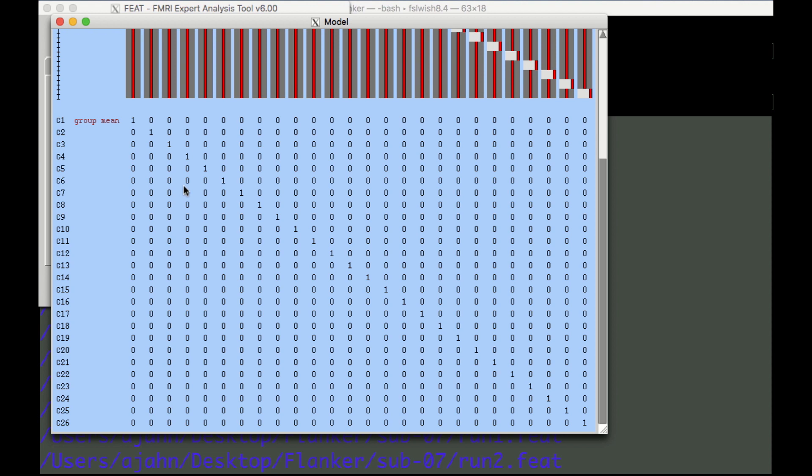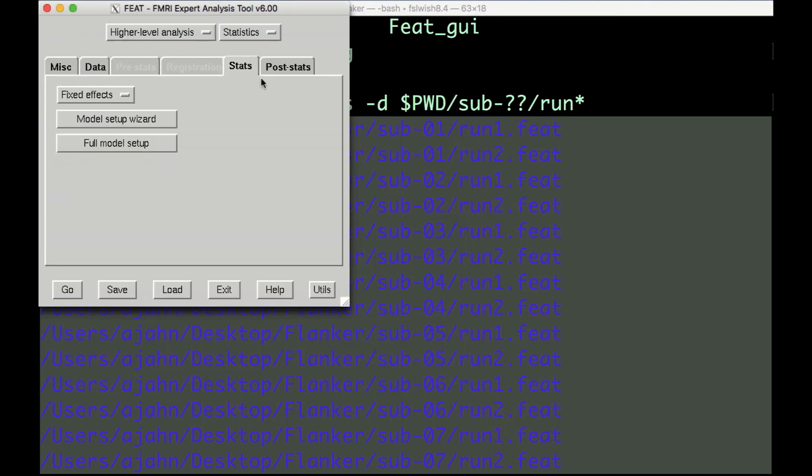Now go back to the Feat GUI. As with the first level analysis, we will ignore the Post Stats tab for now, since we're not performing a population inference. We'll cover this in more detail in the next tutorial on third level analysis. For now, click Go, and let this analysis run for the next few hours.